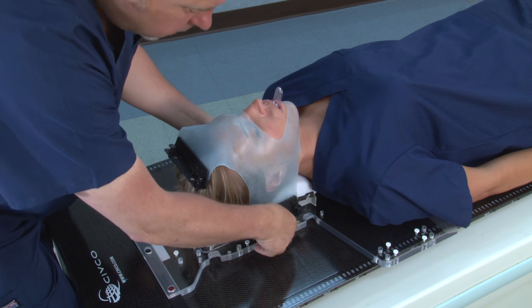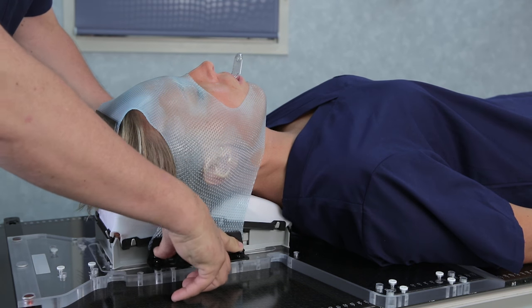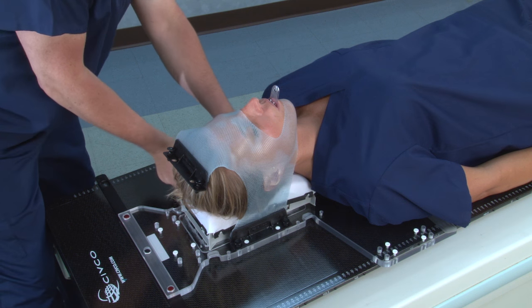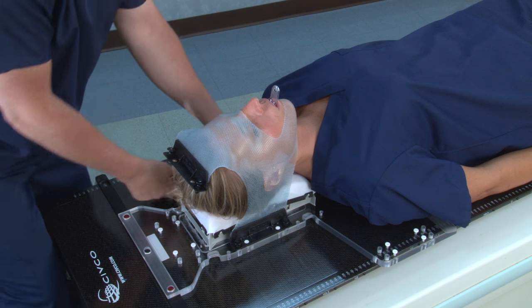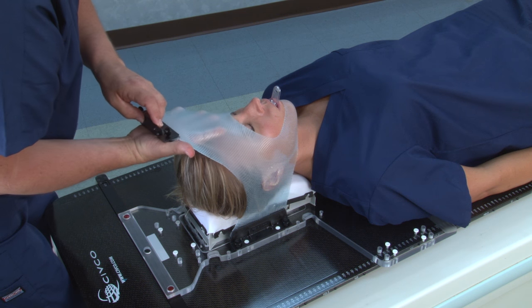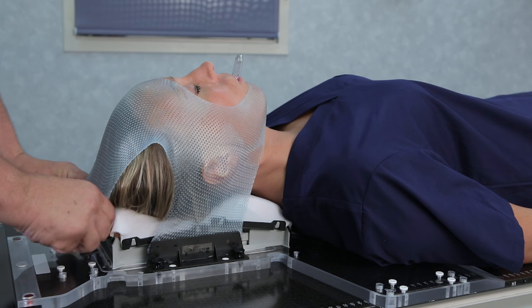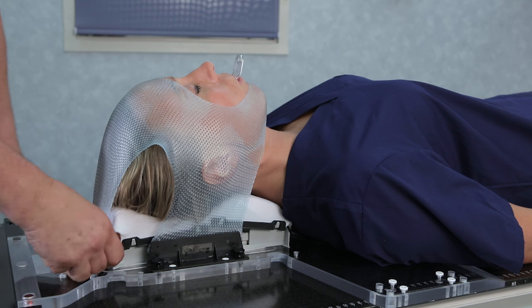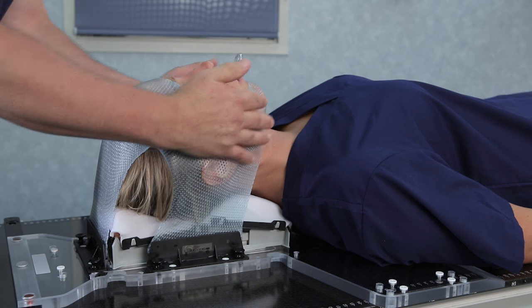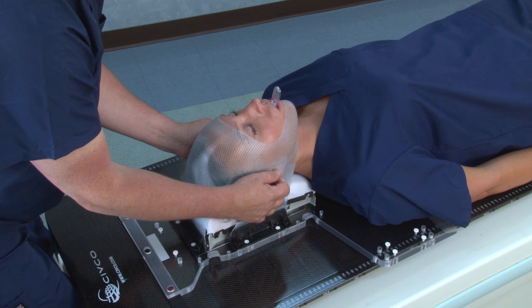Pull the sides of the mask down. Make sure the bottom of the mask is slightly over the chin, and then lock down the side pieces. Pull the top portion of the mask down over the top of the head and lock it down. Make sure the top portion of the mask is formed just above the patient's eyebrows. Then, mold the mask around the patient's ears and under the chin. This will help with superior and inferior reproducibility.